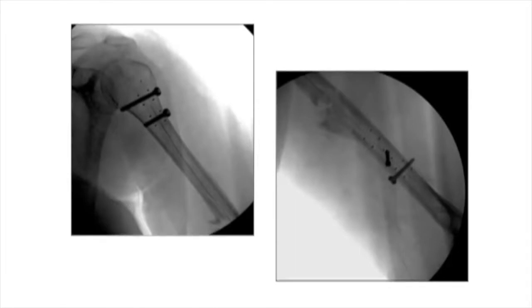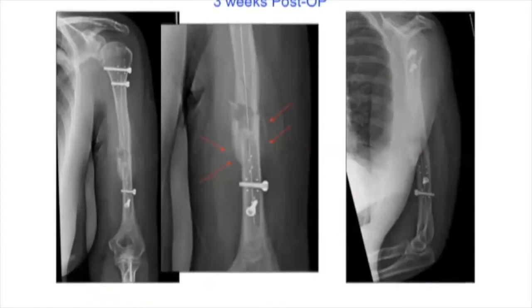And so because of that, they actually place these little metal wires in there to guide and show you where everything is supposed to belong. The interlocks obviously are metal implants. You can see here at 3 weeks, you're already starting to see a pretty significant degree of callus formation, which is really not typically seen in metal implants.